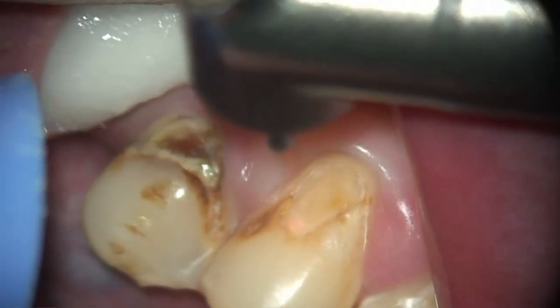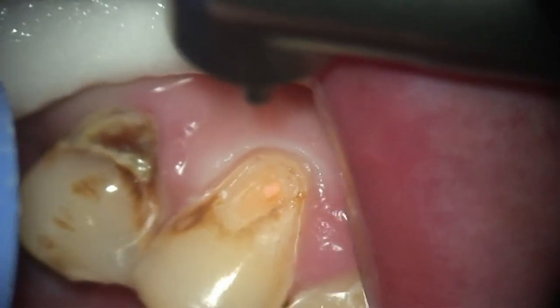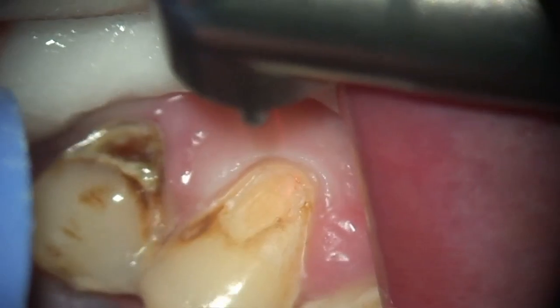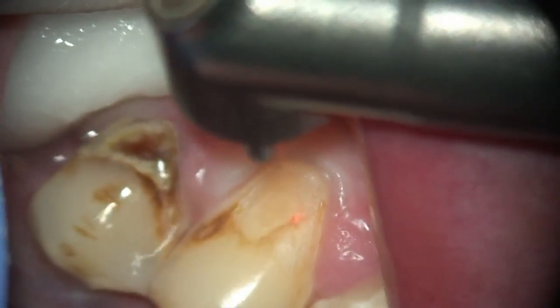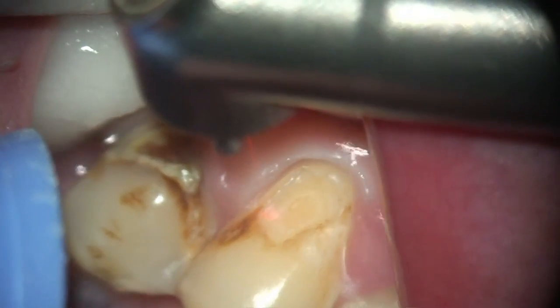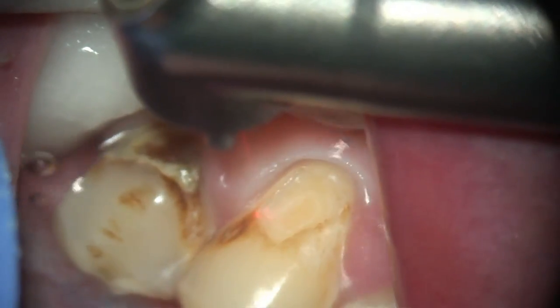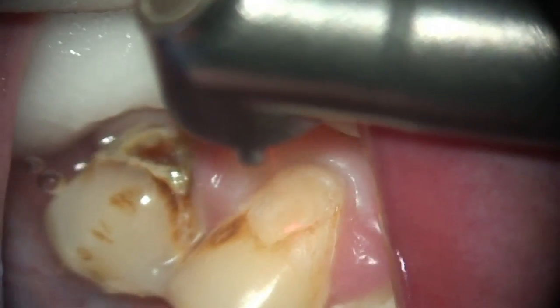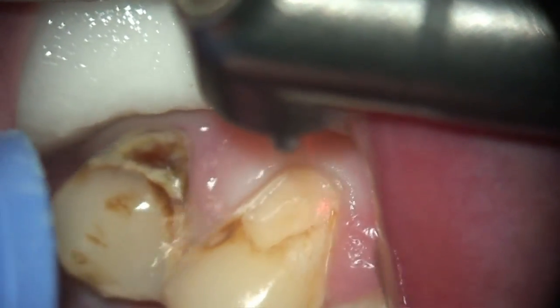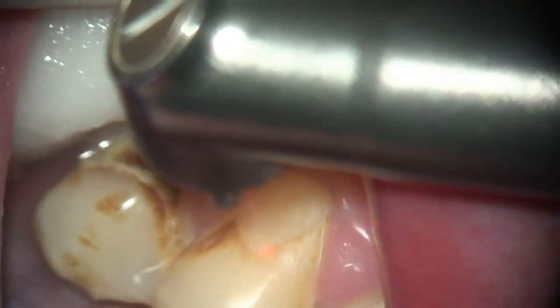This setting also allows for precision removal of decay and decalcified tooth structure. Once you learn how to use the laser — which we teach in the advanced training classes — you learn how to place either a bevel or a butt margin, or whatever type of margin you're looking for with your final restoration before you place it.